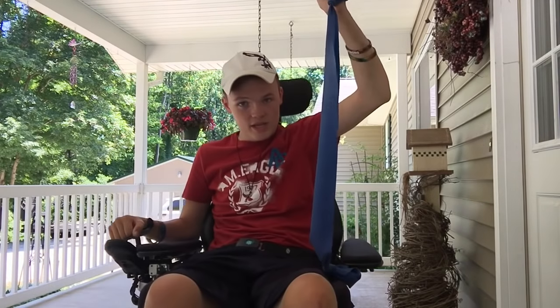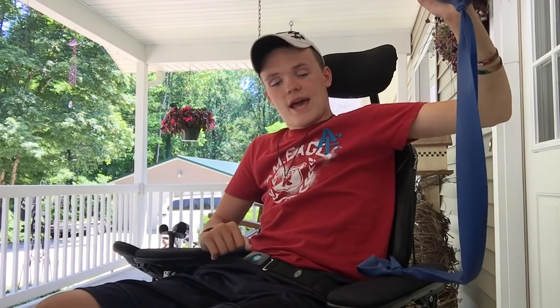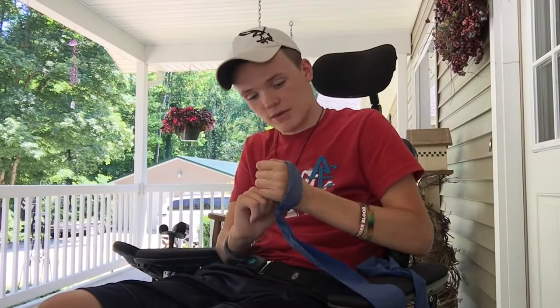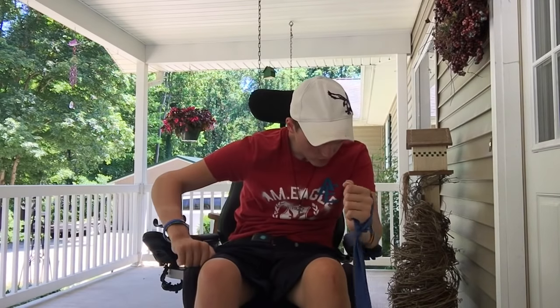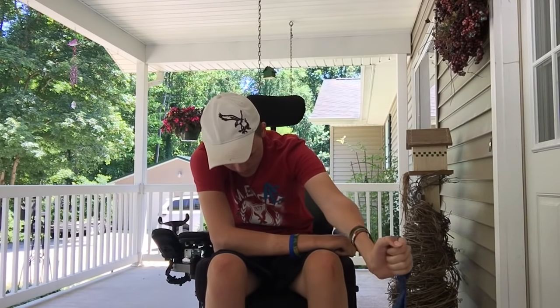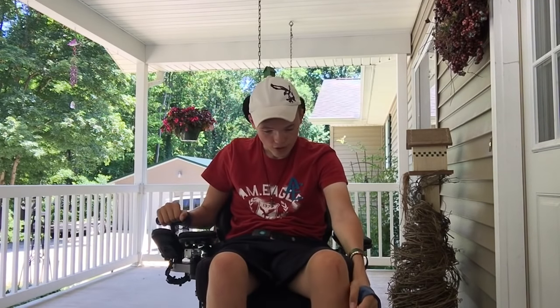And I put this down and lay it in front of my left wheel or right wheel, depending which arm I do, and I make it to where it is like this on the floor, kind of like an L at a 90 degrees. Then I'll roll forward to where my wheel is over this, almost like someone's standing on it, and I will put my arm up like this. I normally put this around my wrist, which I'll do in a second, so I'll demonstrate here. So back up and put this in front of the wheel and lay it down at a 90 degree, like I said. And the closer you get to the middle of the band with your wheel, the harder it's going to be.